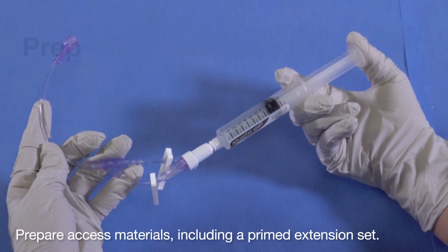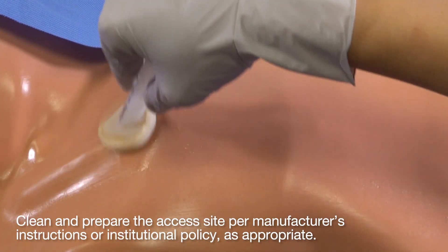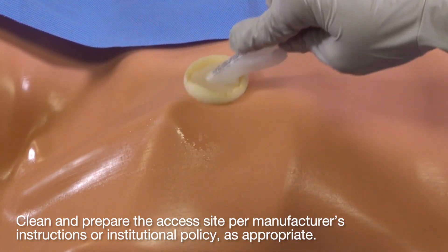Prepare access materials, including a primed extension set. Clean and prepare the access site per manufacturer's instructions or institutional policy.